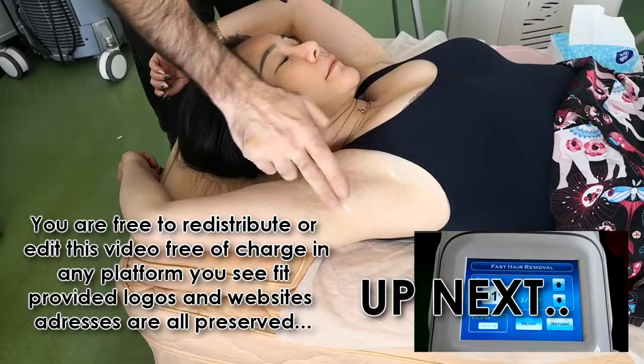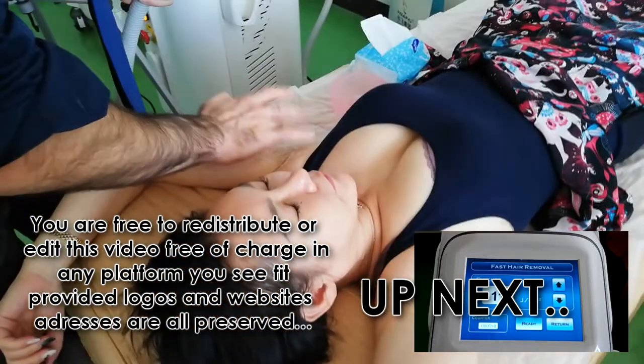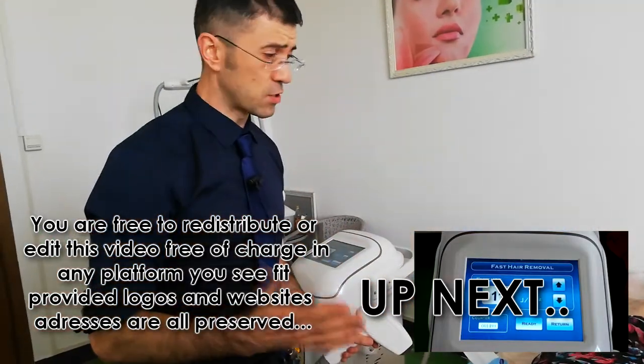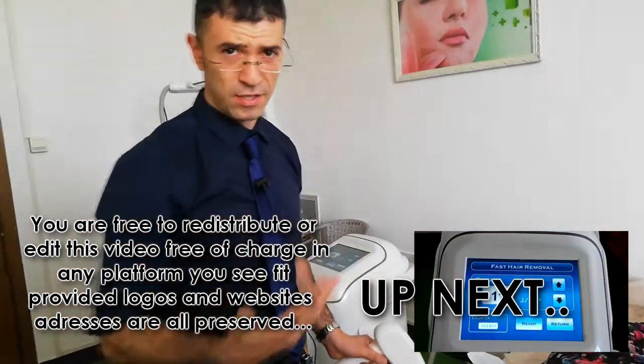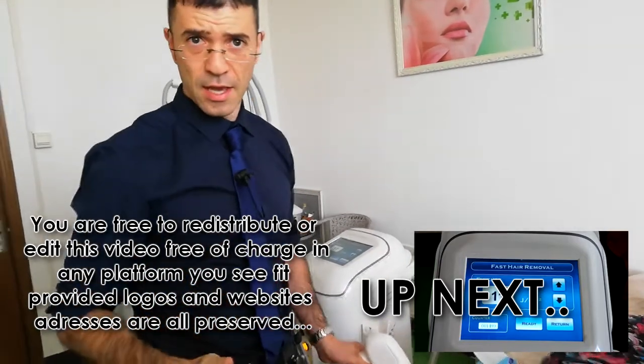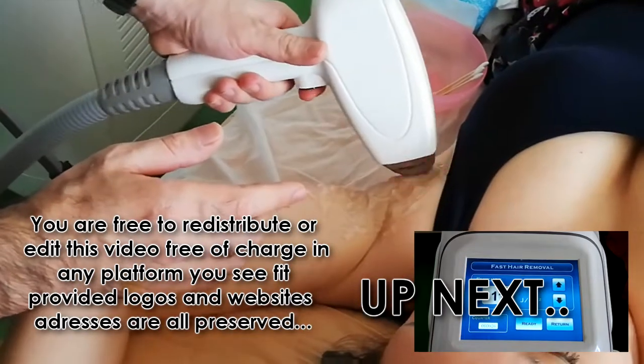But actually what that means is that we're almost done with the treatment. So here is quite warm, and here the area which we haven't done is quite cold. And this function is extremely good, for example, for large areas, for example, your legs and so on, for example, my arms and so on, because you can actually do the treatment really, really quickly. I'm going to do it with my left hand.